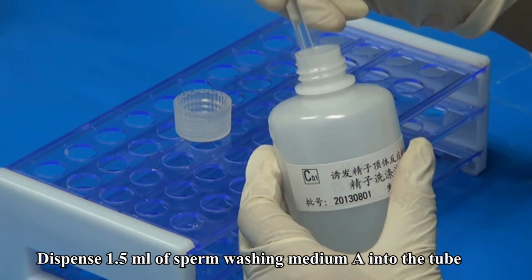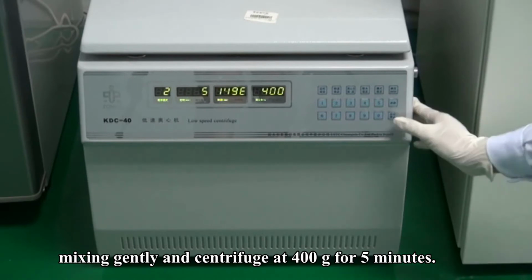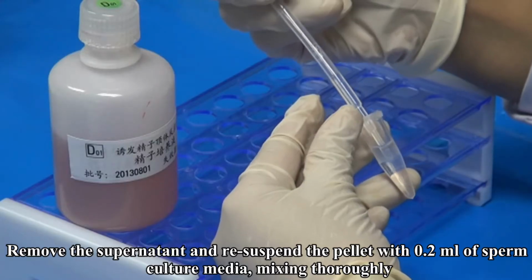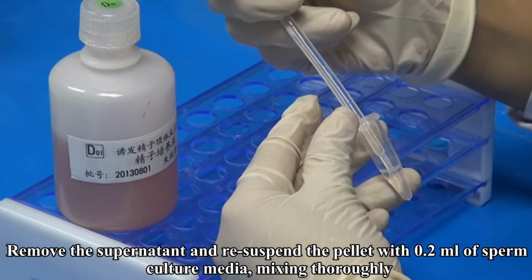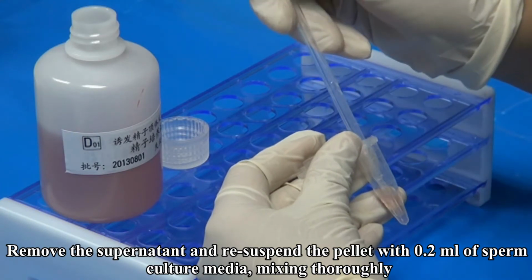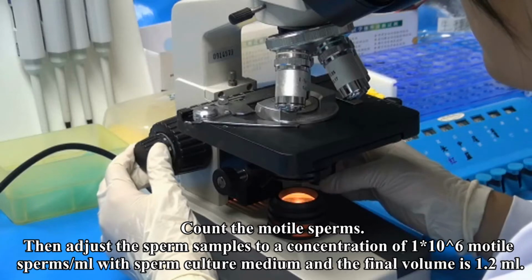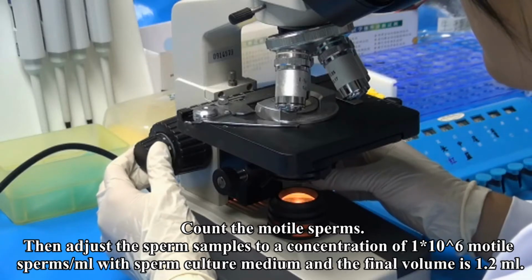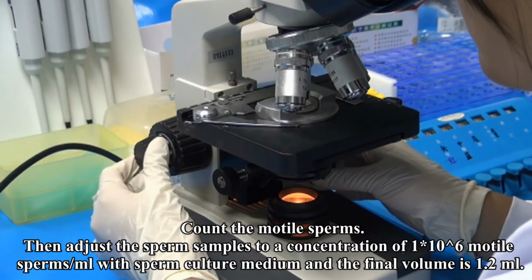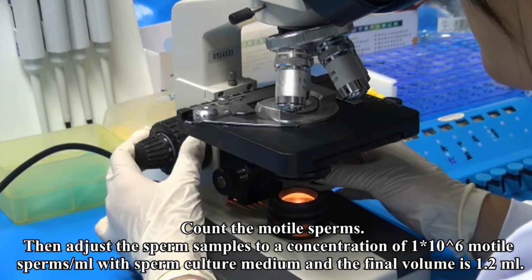Dispense 1.5 ml of sperm washing medium A into the tube, mixing gently and centrifuge at 400 grams for 5 minutes. Remove the supernatant and resuspend the pellet with 0.2 ml of sperm culture media. Mixing thoroughly. Count the motile sperms. Then adjust the sperm samples to a concentration of 1 times 10 to the 6th power motile sperms per milliliter, with sperm culture medium and the final volume is 1.2 milliliters.